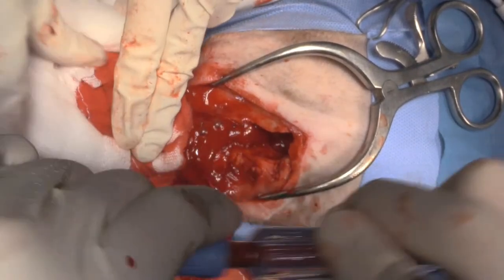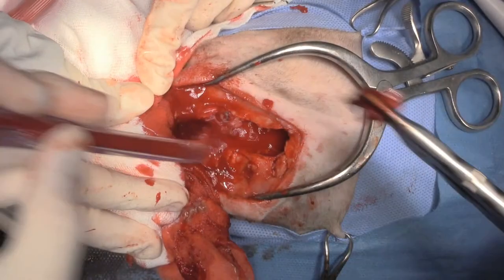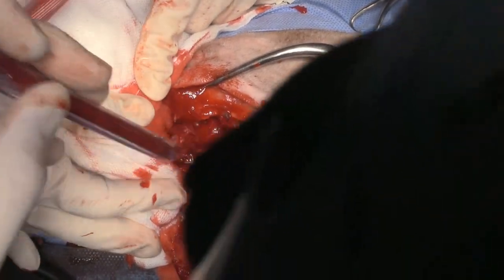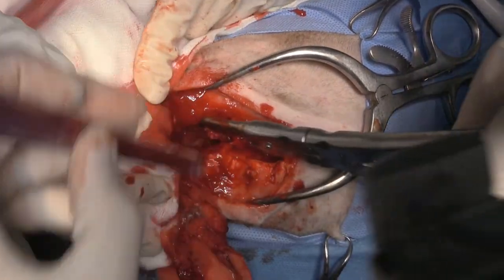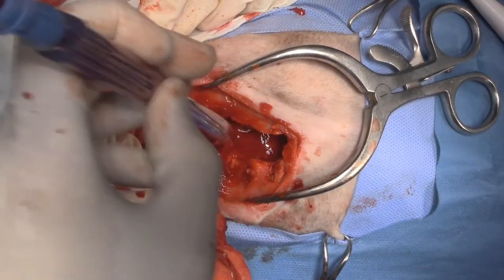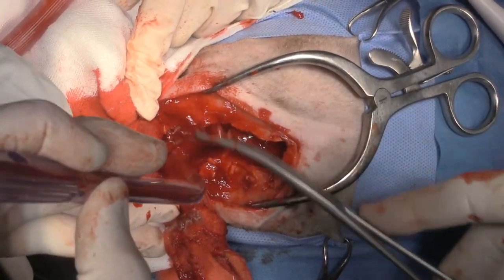And so we're monitoring our blood loss by weighing the suction bucket. I'm just keeping track of what's going into the bucket. I have had one dog bleed to death during this procedure, but it had bled quite extensively before we even got into surgery, and so it would have used up all of its clotting factors. Tissue there.